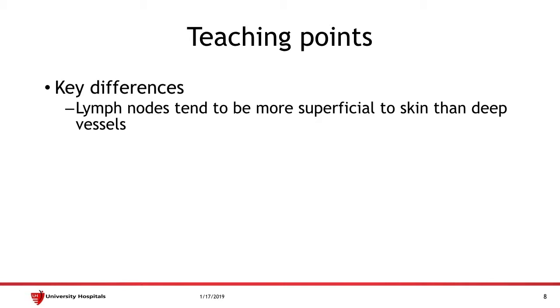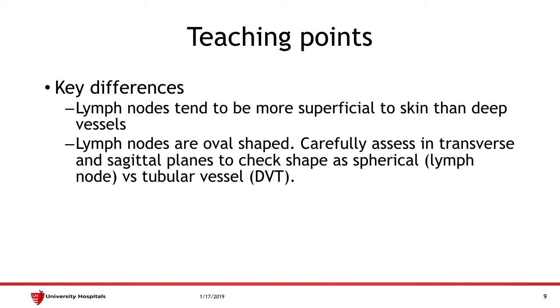As for the key differences between a DVT and a lymph node: lymph nodes tend to be more superficial to the skin than deep vessels — in this case, it was in a more superficial fascial layer. The second point is that lymph nodes should appear as an oval shape. You need to carefully assess the object in question in both transverse and sagittal planes to check the shape. Lymph nodes should appear as a spherical object, whereas femoral veins and DVTs will appear as a tubular vessel.